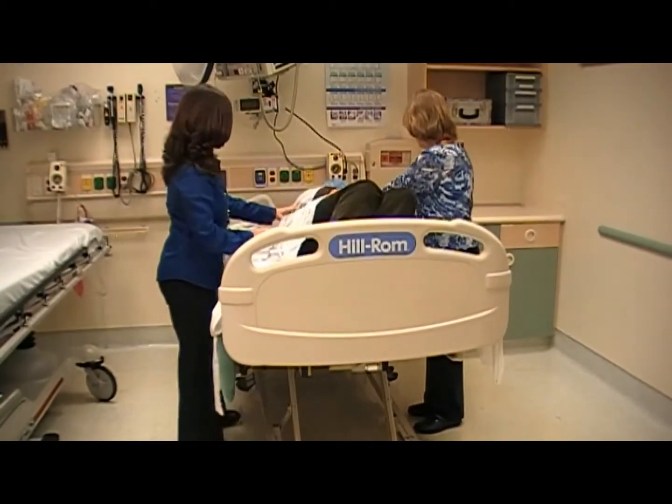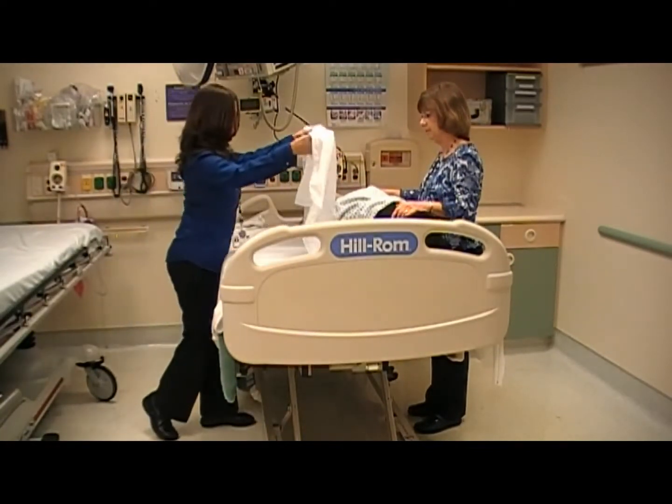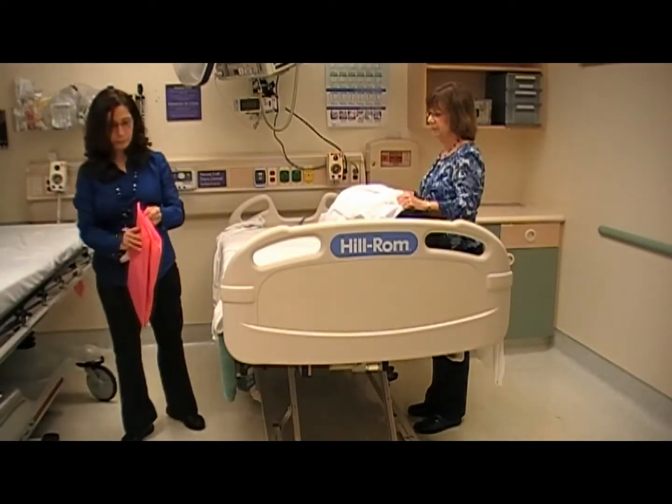Bend the patient's knees and turn toward you, asking the patient to hold the bed rail and pull to assist. If needed, use the draw sheet to finish turning the patient toward you.